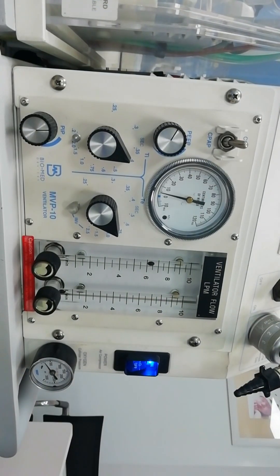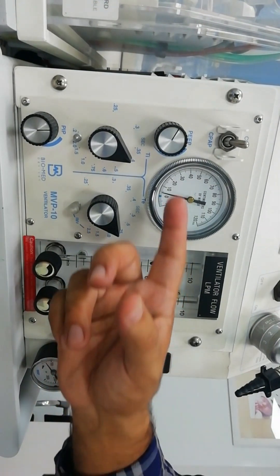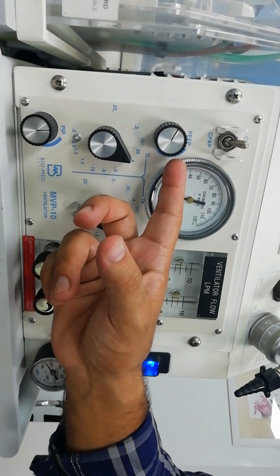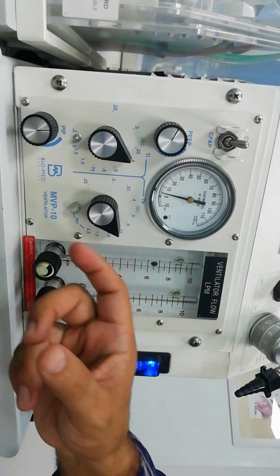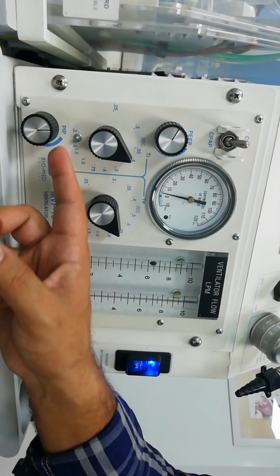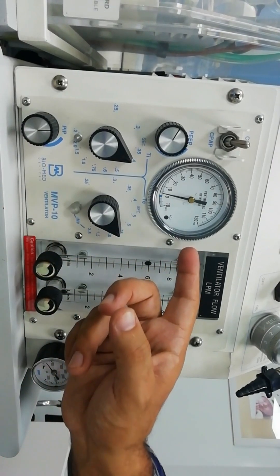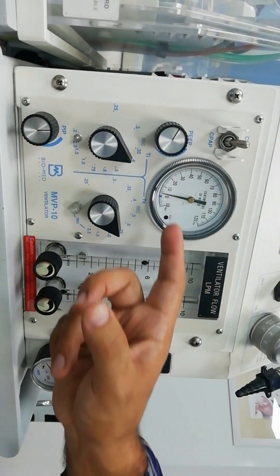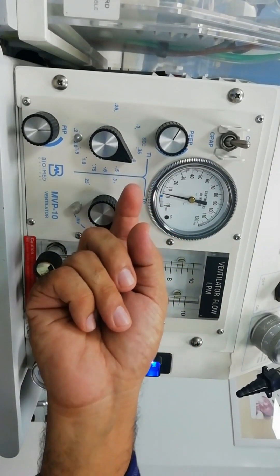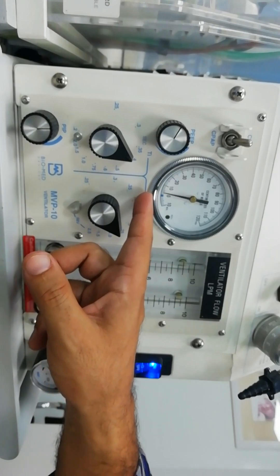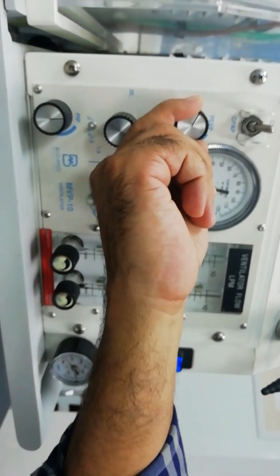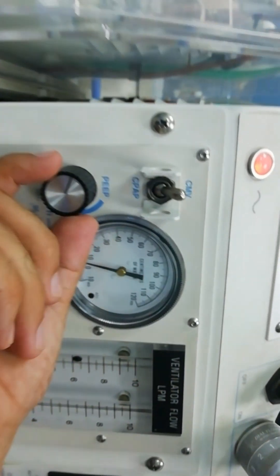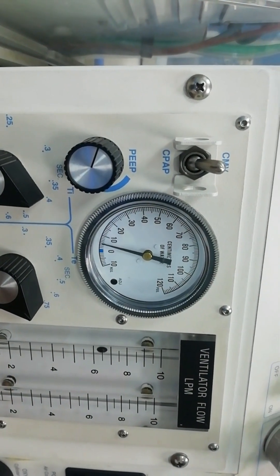For controlling the controlled mechanical ventilation mode we have to set two parameters. One is the positive end-expiratory pressure or the PEEP, and the peak inspiratory pressure or the PIP. So you can see we have the pressure gauge and we can see the PEEP is set around three. So we can increase the PEEP to the desired. Usually we keep it at five or four depending upon whether the patient is preterm or term.